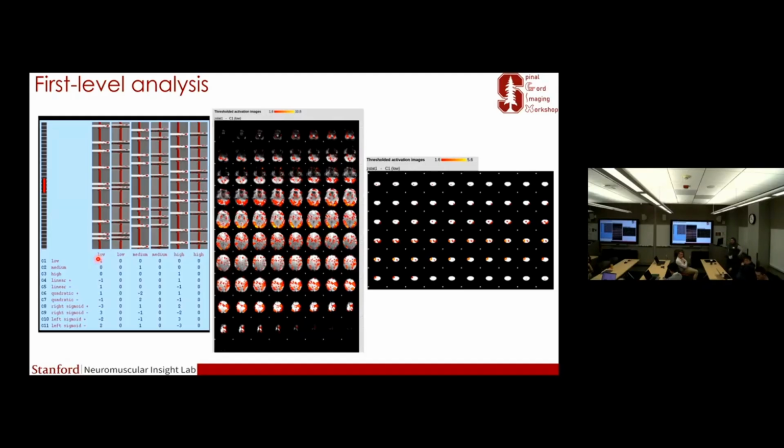The sequence does acquire them, but doesn't save them. So you don't need to care about it. That's a good point. Also, for example, for our pain studies, we would also remove the first trial because they would be very shocked and surprised, so there might be even a task-based reason for that too.